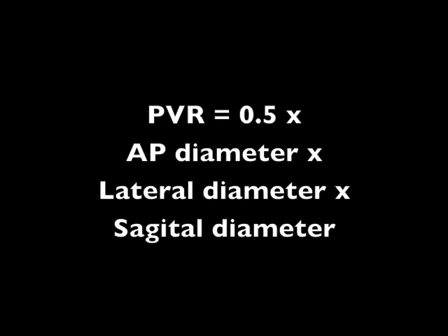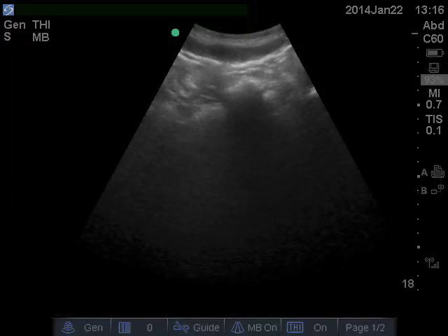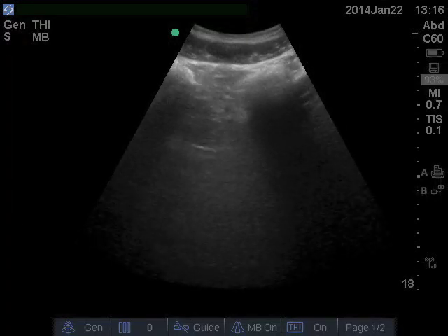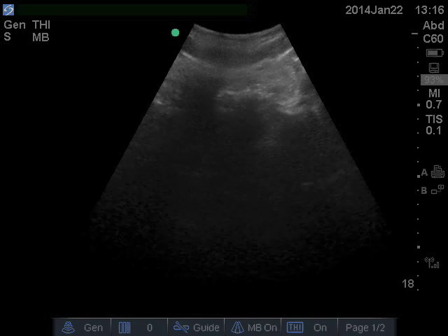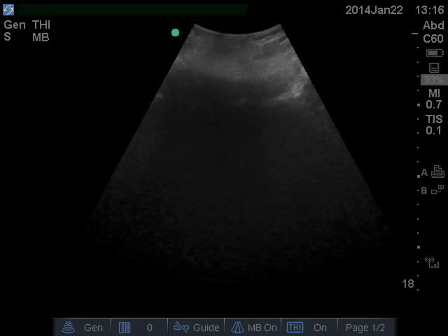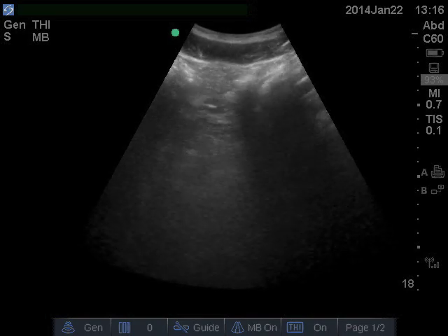Now multiply these three numbers by one half and you will have a good estimation of the post-void residual. If you are rocking the probe all over and all you see is a bunch of shadows and no obvious bladder, the bladder is empty.